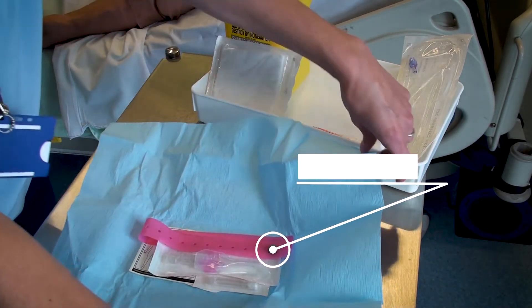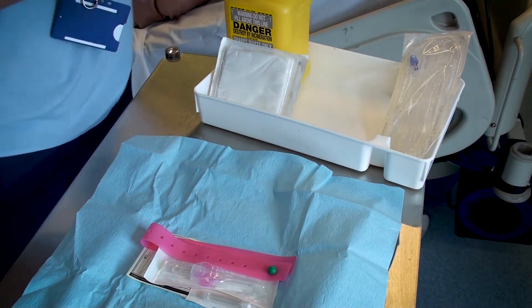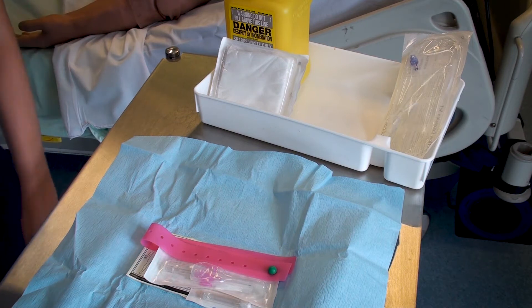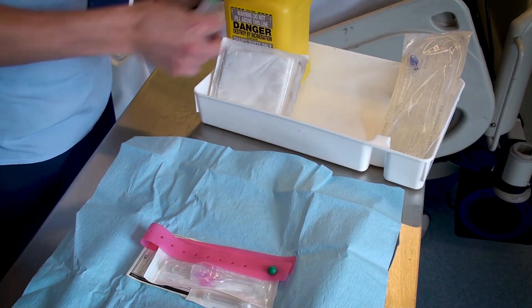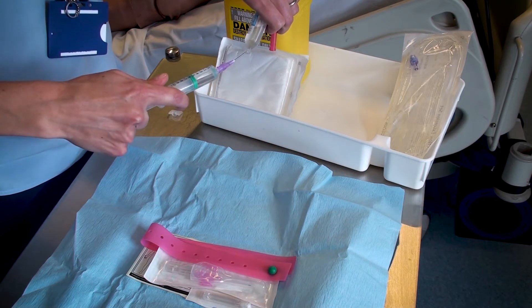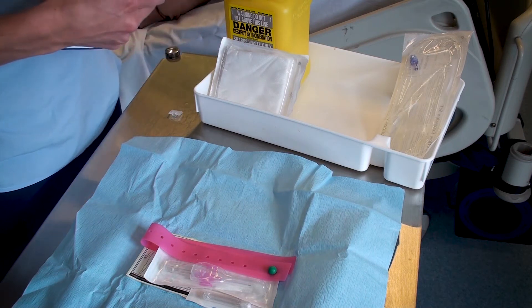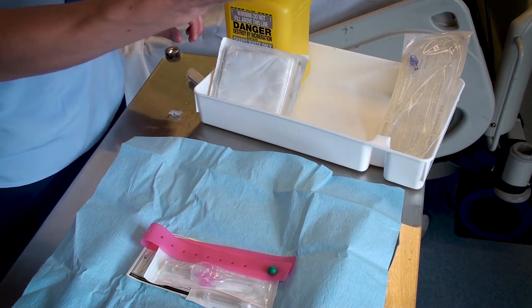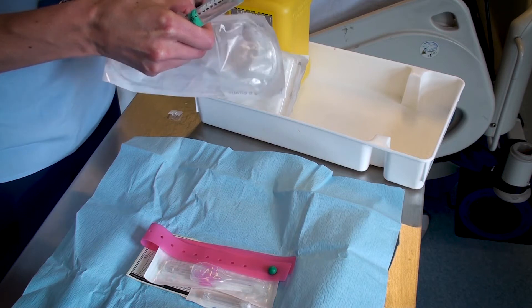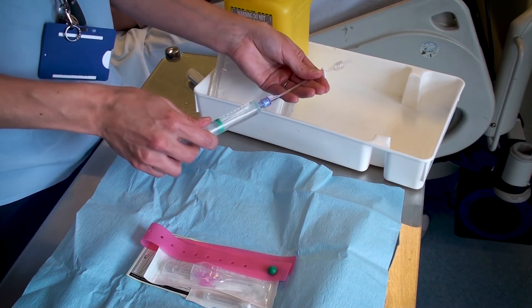Within the pack, you will find a tourniquet, appropriate size cannula, skin preparation wipe, a label for putting in the patient's notes and a dressing. In this example, we are not using pre-prepared 10ml syringes with saline already in situ, so we will require a drawing up needle, a 10ml vial of 0.9% normal saline and a 10ml syringe. When preparing all the equipment and drawing up the saline, you must ensure an aseptic non-touch technique is maintained at all times. You must also ensure that the octopus, bung or extension set being used is pre-primed prior to the procedure. This is to ensure that no air is left in situ and the patient receives no air emboli. You also require gauze, which doesn't come within the cannulation pack.